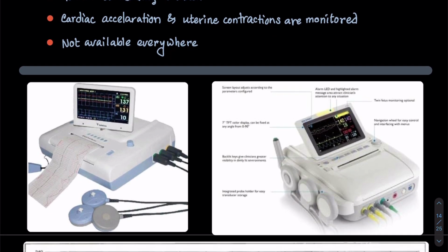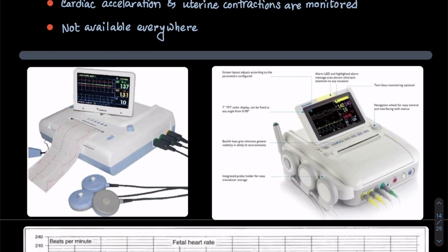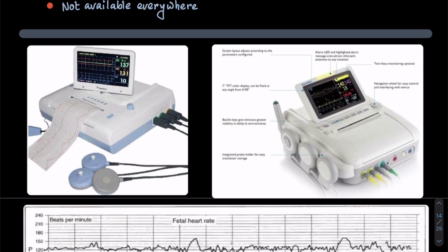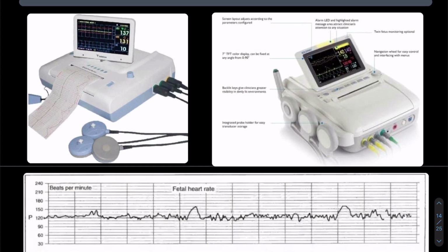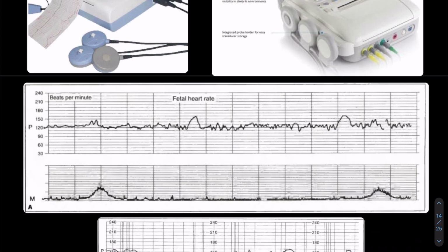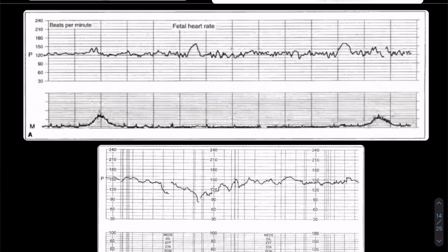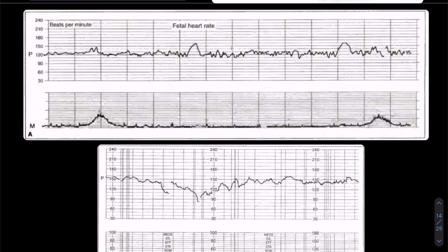Let me make it more clear. During a non-stress test, uterine contractions and fetal heart rate monitoring occur through the use of a cardiotachometer and Doppler. I have shown here some CTG machines. It's quite like ECG procedure. The patient presses a marker whenever she observes fetal movement. The cardiotachometer records a pattern of fetal heart rate. This includes both a baseline heart rate and any periodic changes, in particular accelerations or decelerations from the baseline rate. The tracing comes like this.